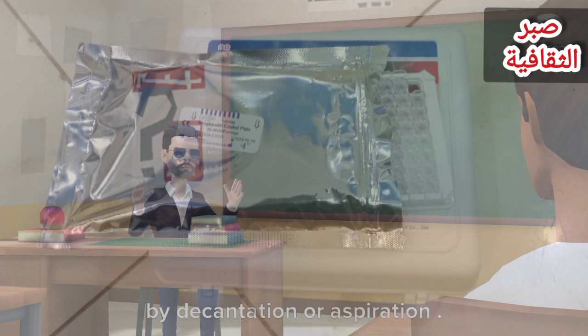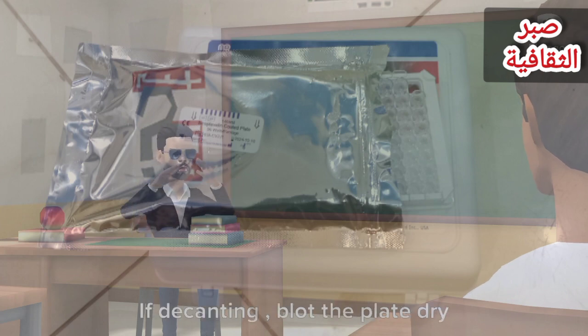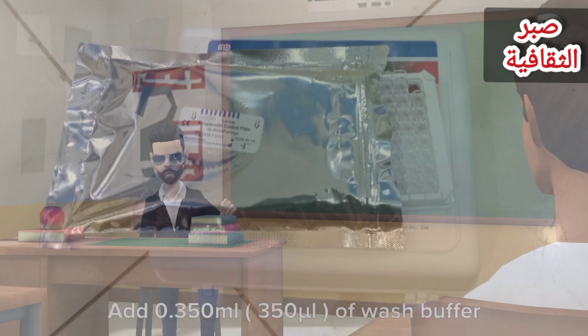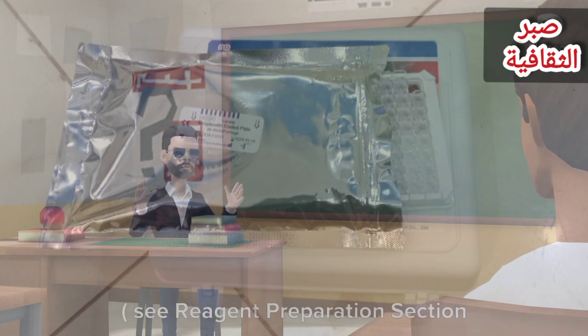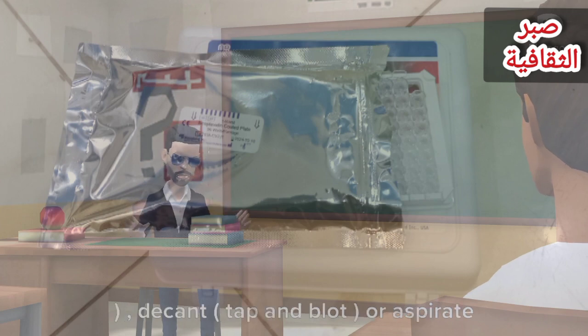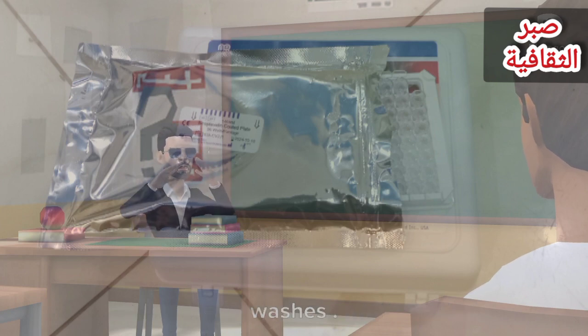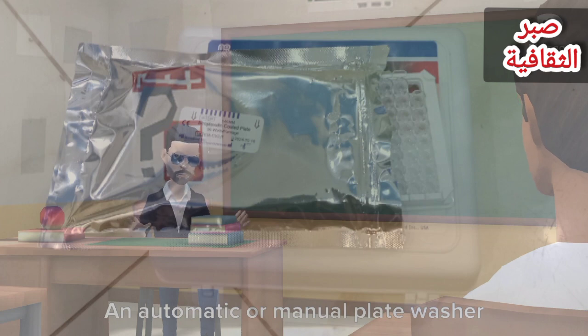5. Incubate 60 minutes at room temperature. 6. Discard the contents of the microplate by decantation or aspiration. If decanting, blot the plate dry with absorbent paper. Add 0.350 milliliters, 350 microliters of wash buffer. See reagent preparation section. Decant, tap and blot, or aspirate.